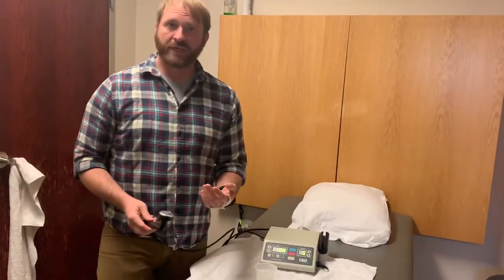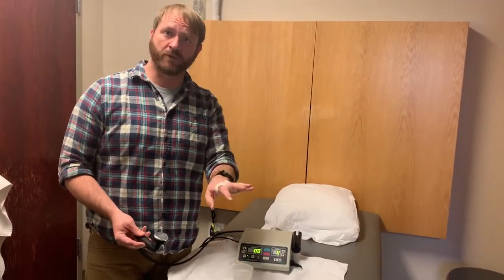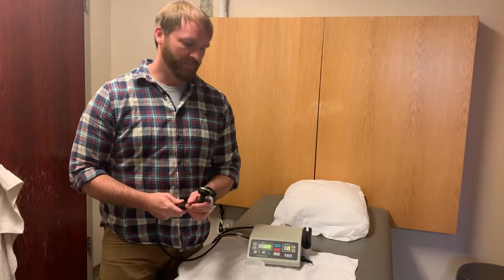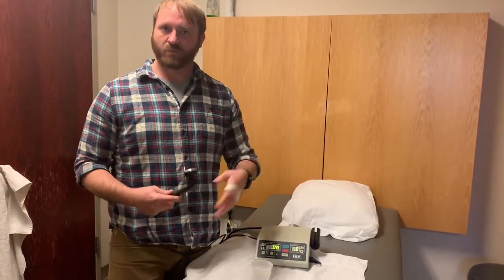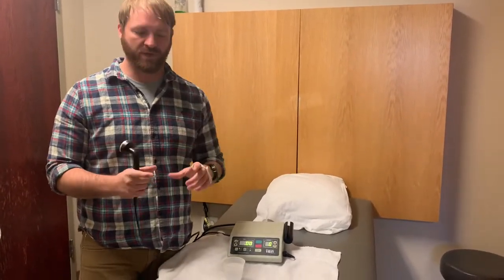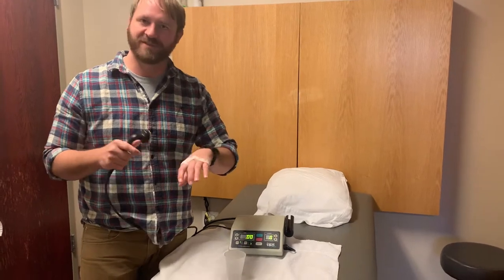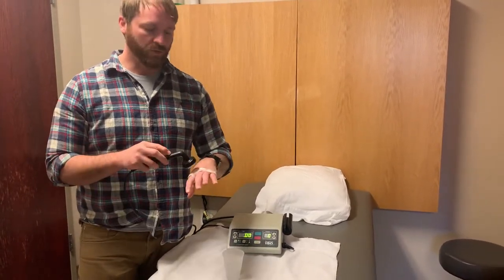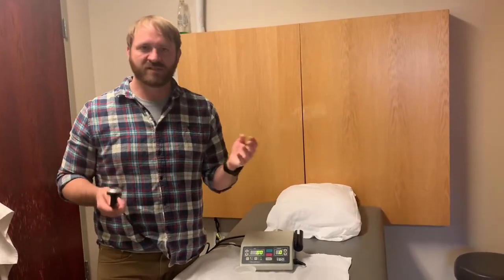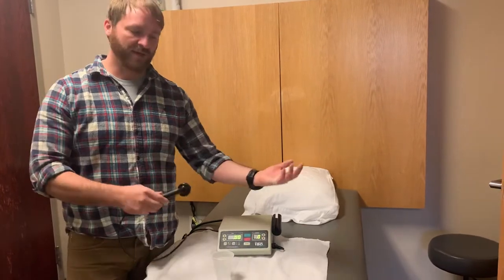Ultrasound can also be performed using a number of different mediums. I showed you with the ultrasound gel already. There are also little packets that you can get that have a conducting gel inside that's reusable. You can also use a little plastic bag filled with water if you have a sound head that's large but need to get a specific knuckle or irregular area — to increase the conductance between the sound head and that smaller area so you're not losing conductivity.